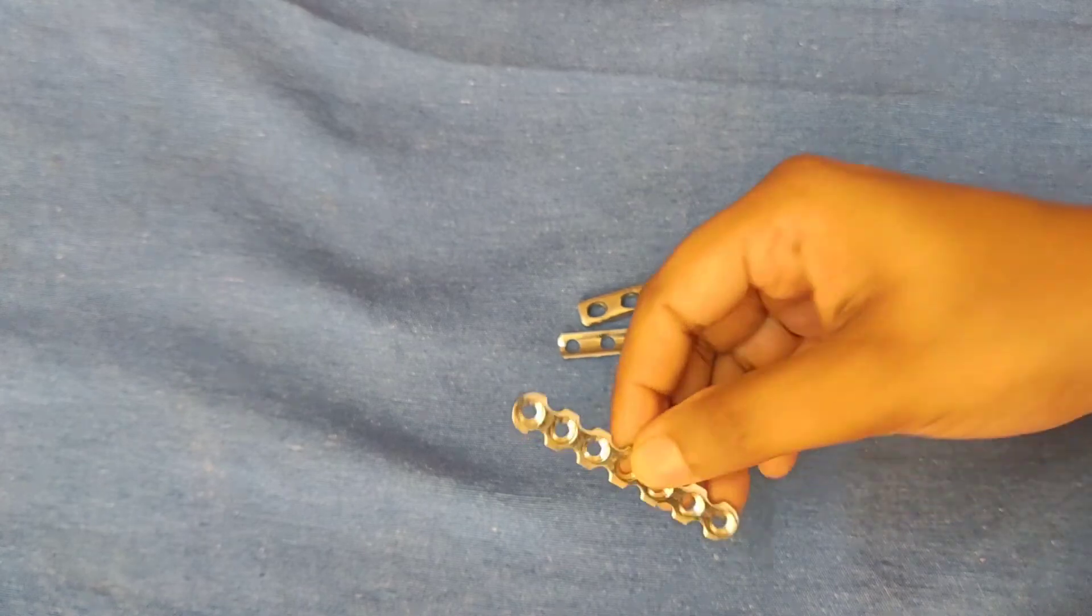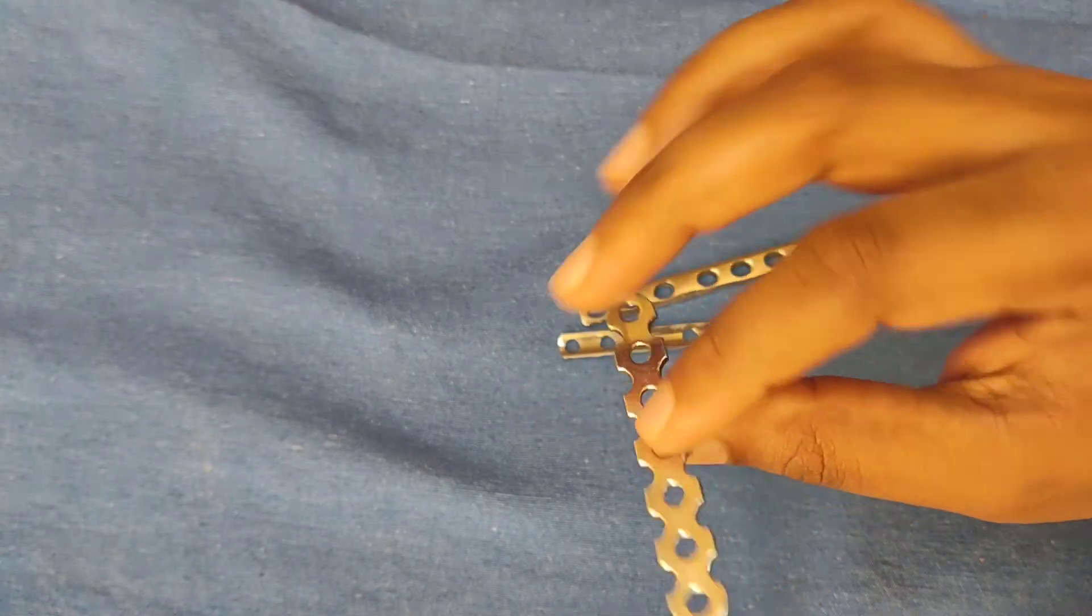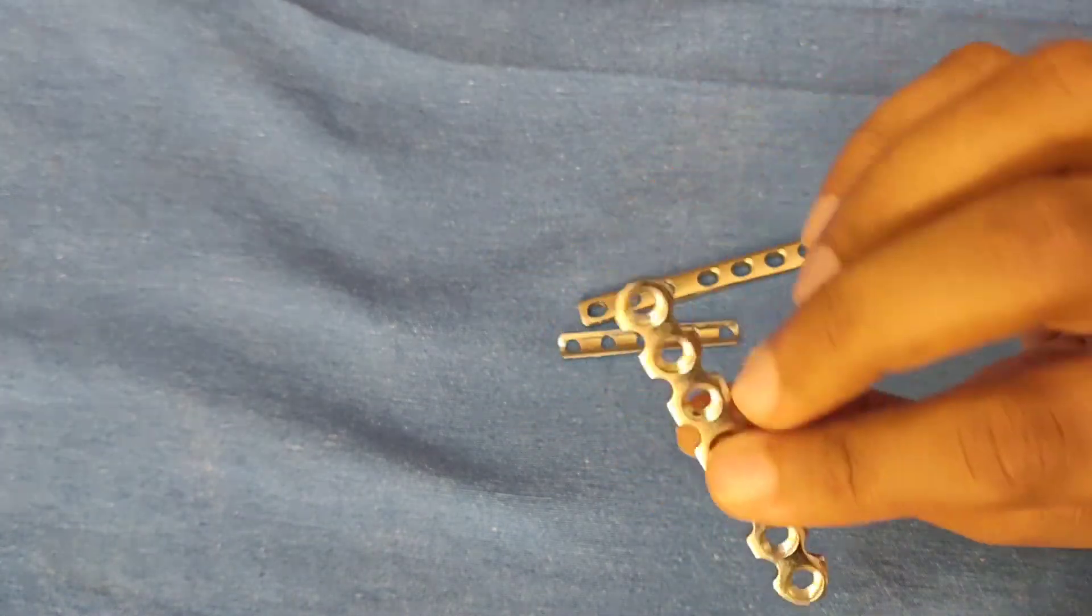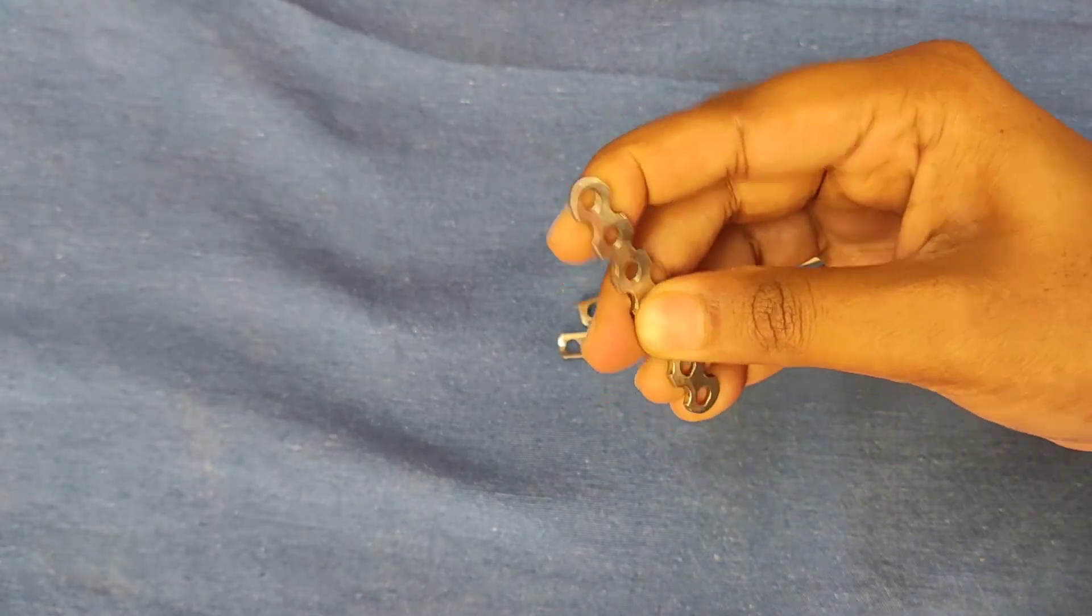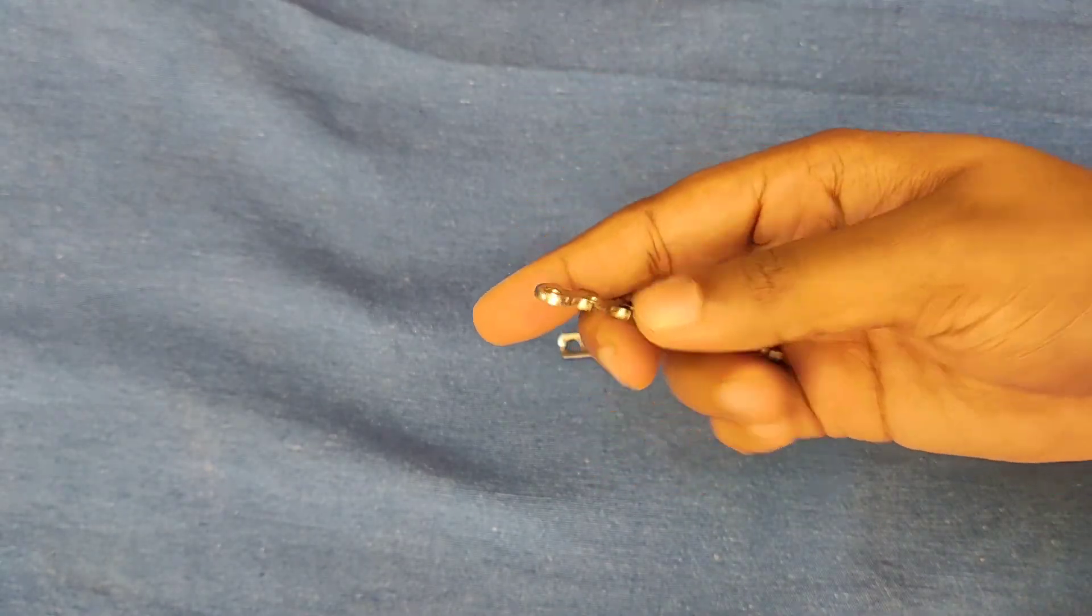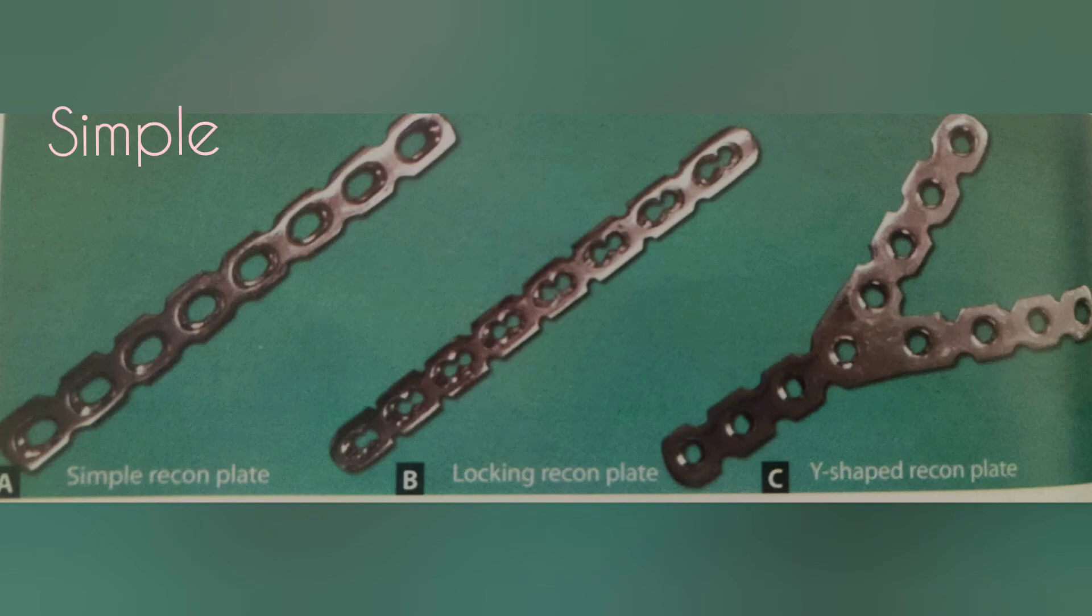Next is reconstruction plates. These plates can be molded manually according to the contour of bone. There are various types of reconstruction plates. There are simple reconstruction plate, locking plate or a Y-shaped plate.